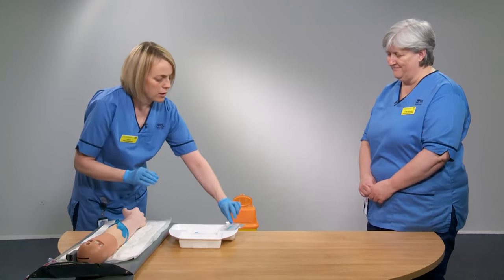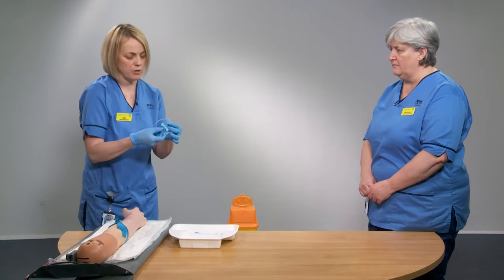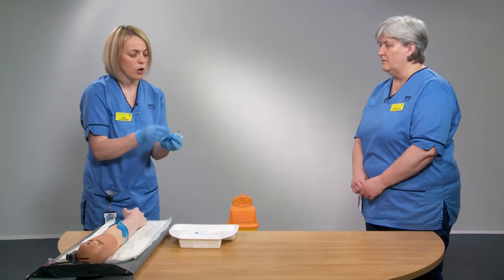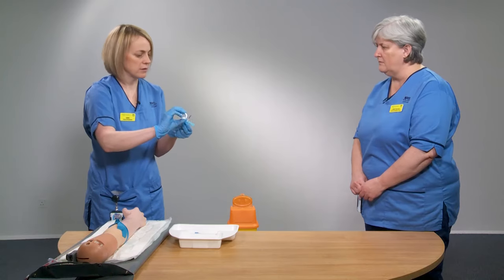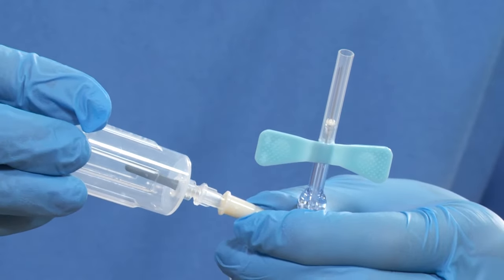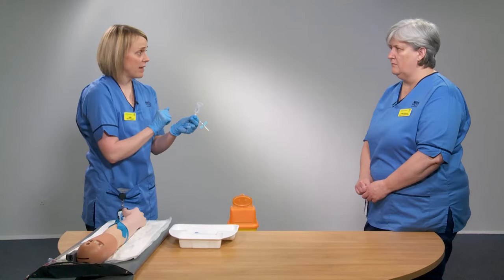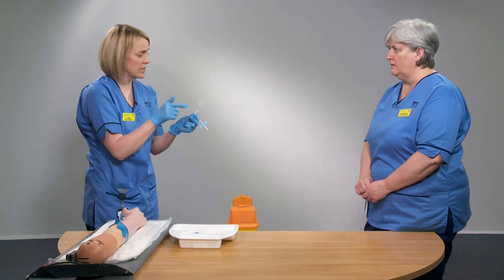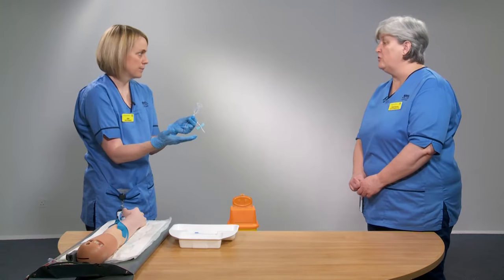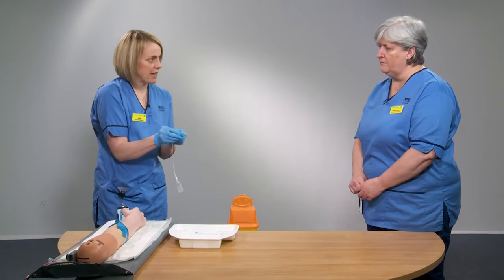Open the butterfly needle package and dispose of the rubbish. At one end you have the butterfly wings — that's the needle end. At the other end is where you attach the vacuette container for the blood bottles. Gently unscrew the sheath and attach the vacuette container securely. Importantly, do not put your fingers into the vacuette container, as this risks a needle stick injury and could contaminate the blood sample — maintain a non-touch technique.